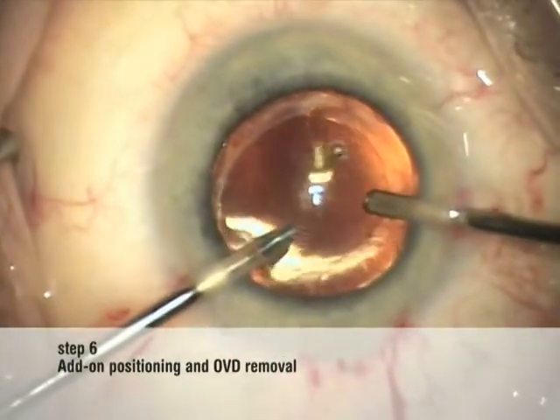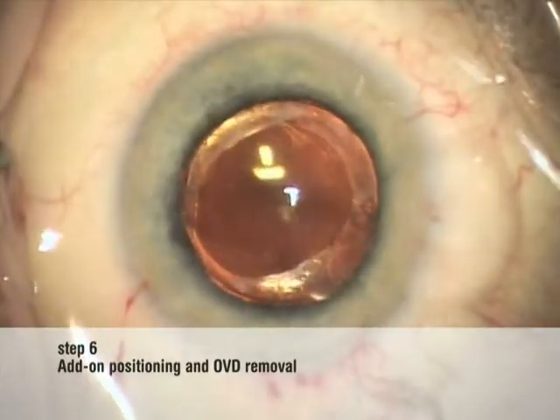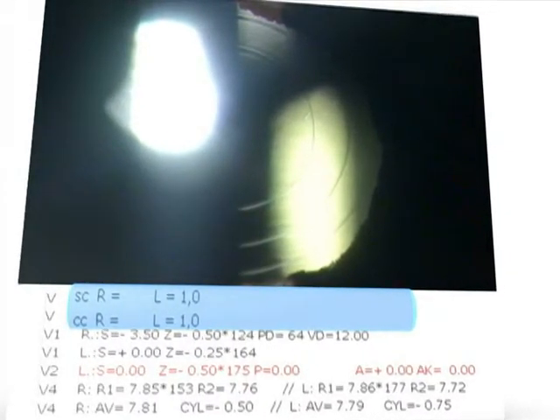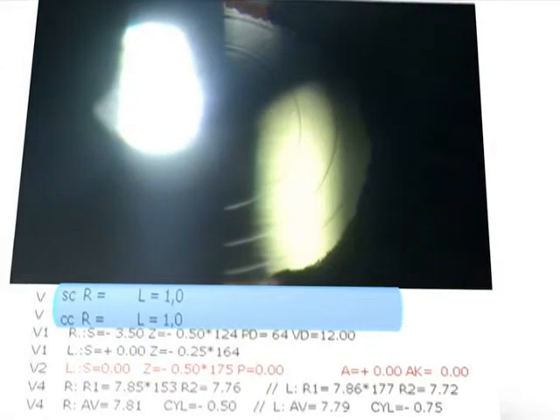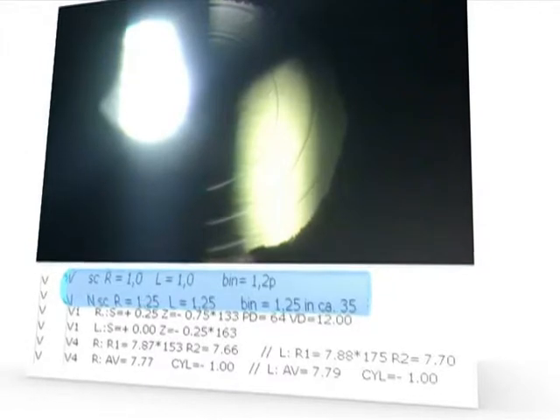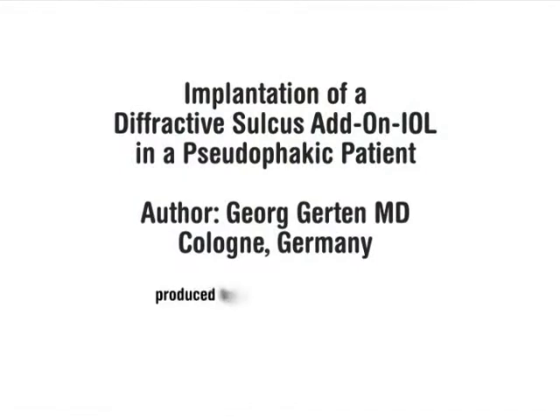The monofocal capsular bag IOL is still well positioned and the opening of the posterior capsule and the vitreous are unaltered. A few days after the add-on implantation, visual acuity is 1.0 (20/20) for both distance and near without any glasses. In the next step the contralateral cataractous eye is treated with phacoemulsification and capsular bag implantation of a diffractive multifocal IOL. With diffractive optics in both eyes the patient sees 1.2 (25/20) binocularly for distance and near. In summary, the patient is able to manage his daily life entirely without glasses.